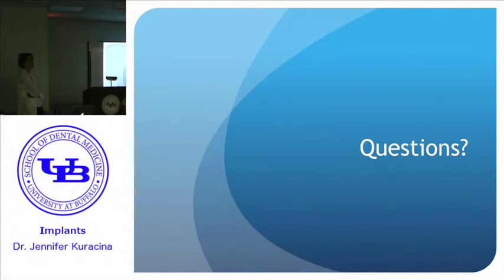Oh, they have to put that. That's been required in the chart. No, see, like for some of the abutments, I don't know if the abutments have stickers. No, they don't. So we can, but there's information. Sometimes they do. They should copy it. Yeah, I was going to ask about the stickers, because some of the abutments, even though it's not a sticker form, there is something which you can glue to the chart.